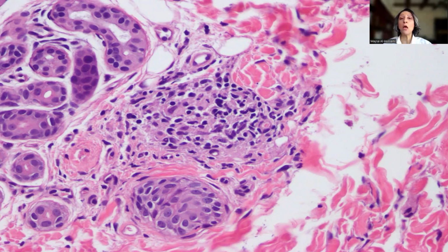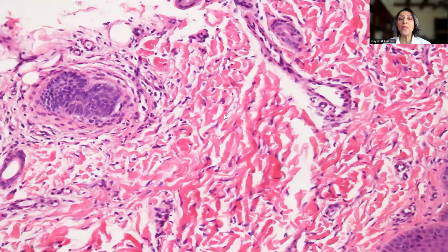but remember that we are not suspecting fungal infection to start with; we are suspecting ZN-positive bacilli. But bacilli are really very difficult to detect with ZN. What we really need in this clinical context is the presence of a granulomatous inflammation, which could be detected only after examining something like 20 deeper levels. And then when we continued on with the deeper levels, the granuloma disappeared.